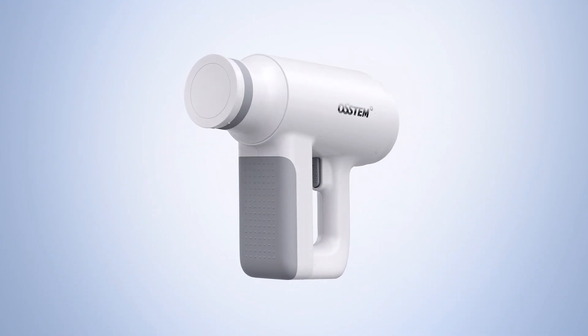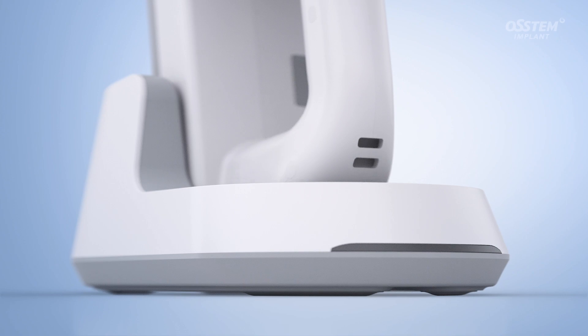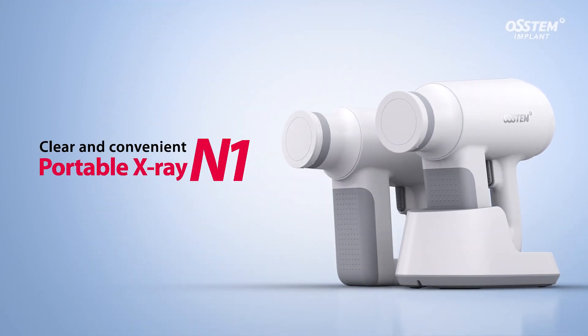Introducing the N1 portable x-ray, delivering high-quality imaging while being extremely easy and simple to use.